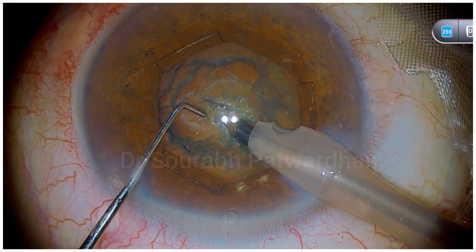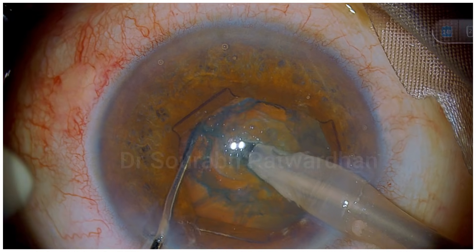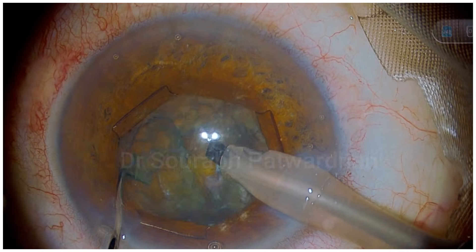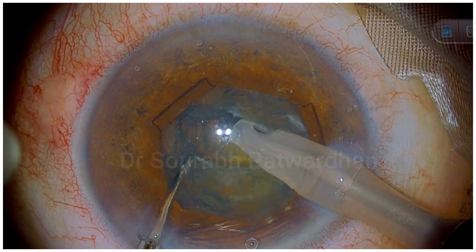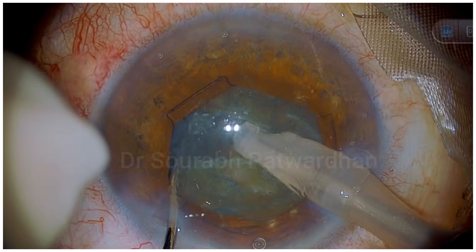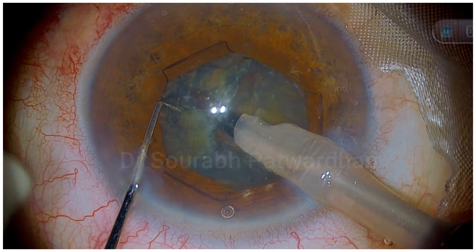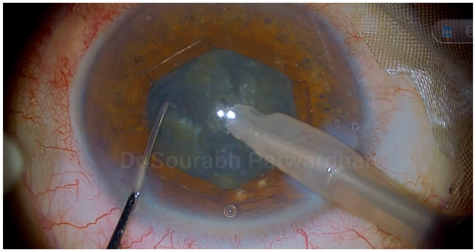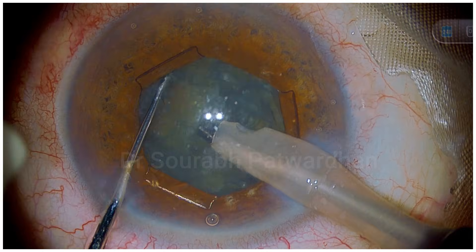The patient is diabetic, and initially I tried to make a half trench and then do the chopping, but as you can see I didn't achieve adequate depth with the phaco tip and that's why it's not dividing completely. So now I shift to the trench-and-divide technique — we must master this technique. Making sure I have a deep trench, my chopper is more than 1.5 mm. You can see the orientation of the chopper in the groove is horizontal, which makes division easier, because in these cheesy cataracts if you hold the chopper vertically it cheese-wires through the nucleus and you don't get a proper division.